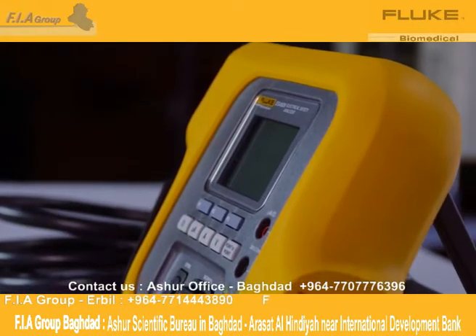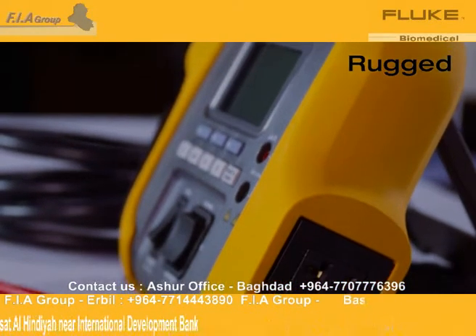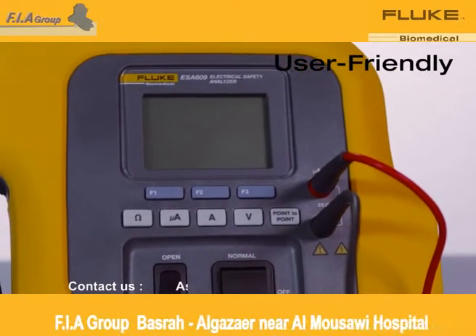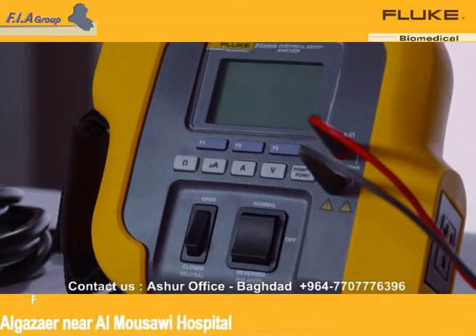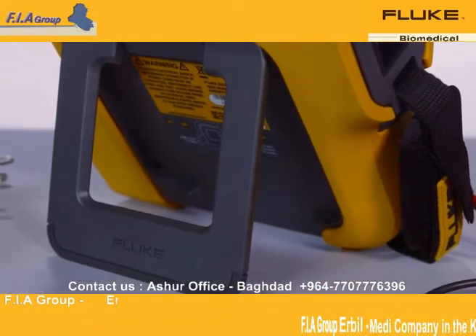The ESA-609 also has a rubberized case that protects it from damage if accidentally dropped, making it ideal for on-the-go testing. Notice how the ESA-609 only has a few buttons. This user-friendly design allows for rapid testing and ease of use. It also has a tilt stand giving you multiple viewing options while testing.